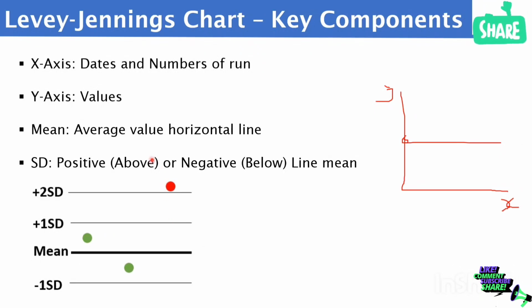Okay. Now remember, we've not started looking at them. Some of the things I've already explained suggest the Westgard rule, but let's ignore that for now and concentrate on the Levey-Jennings chart. What the Levey-Jennings chart will show you is just the graph, as you can see here, or as I've tried to draw here. It will show you exactly where the result, the point of the analysis, is. Wherever you find it can help you to think, is everything okay or is something wrong? Then you find a way to investigate it if you think it's wrong.